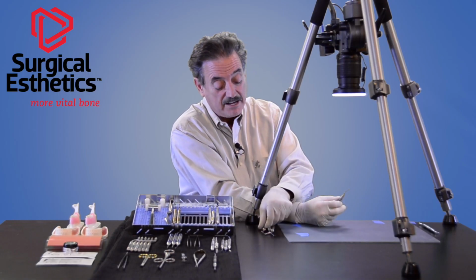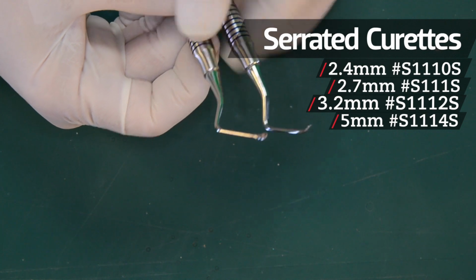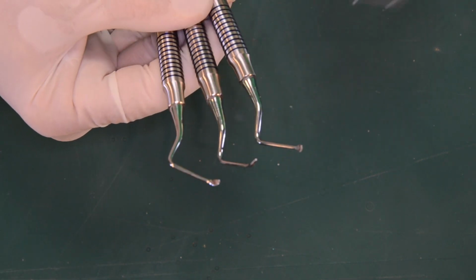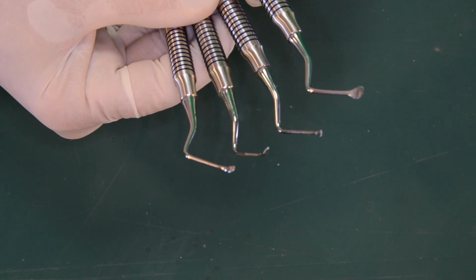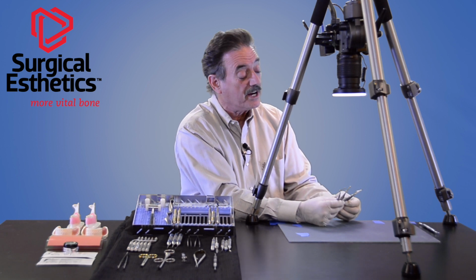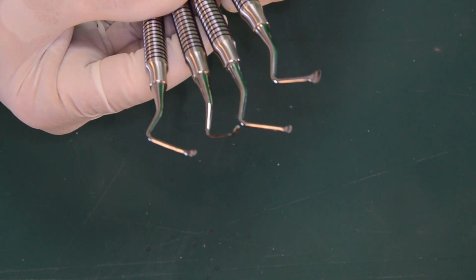And it's really necessary to have different sized curettes, and that is the reason we have a set of 4 of them. They're slightly different angles and different sizes, so you can see these first 2, and then the size of the third one, and then a larger one for larger areas. And I really find that it's beneficial to just rotate through all 4 sizes. When you're cleaning out a socket, you're going to be able to get in some nooks and crannies that you didn't expect were there. So again, the serrated curettes are really critical to effectively doing these grafting procedures.